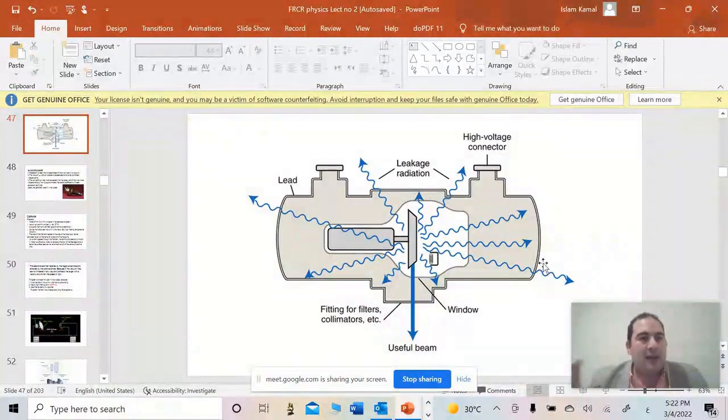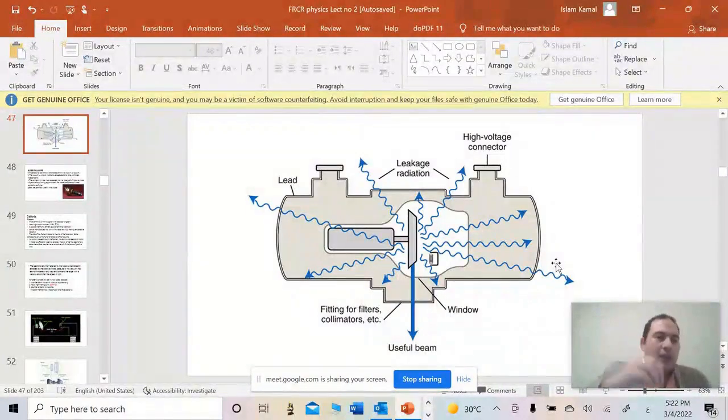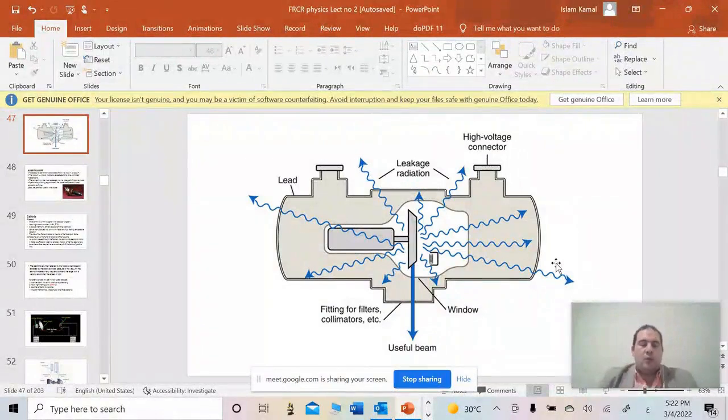Now, this energy fundamentally depends on what? It depends on the energy of your incident electron, which is essentially driven by the kinetic energy you have, right? So, when we talk about quantity and energy, we are clear on that.